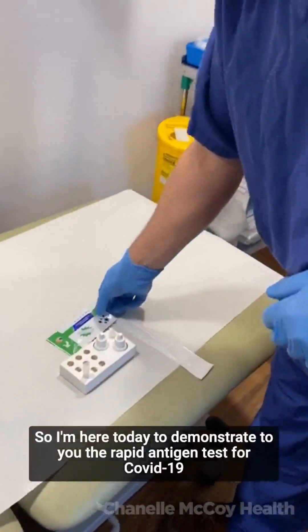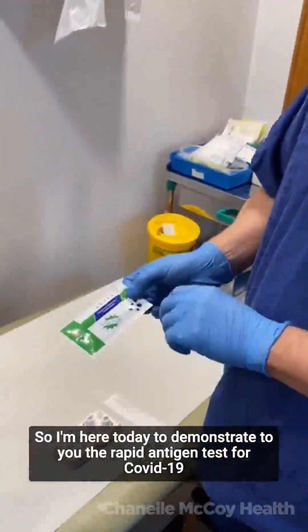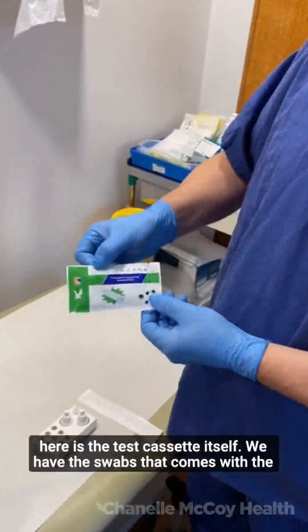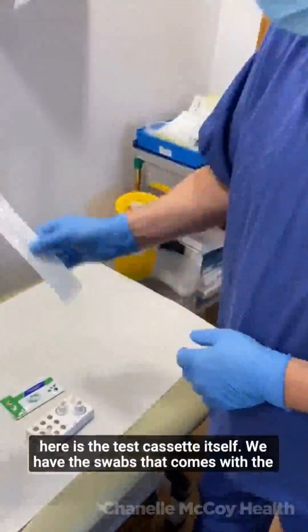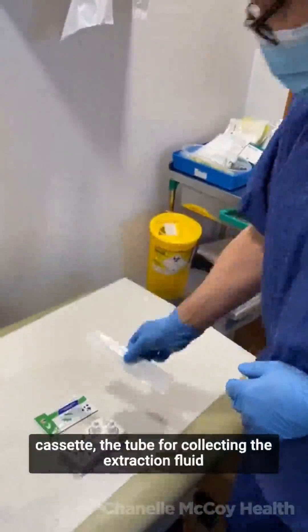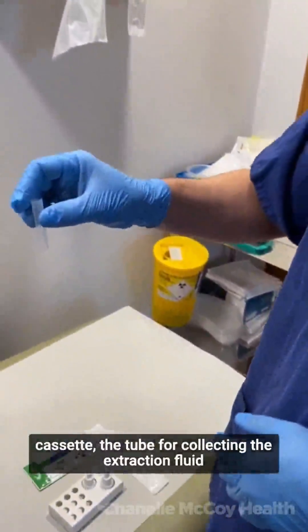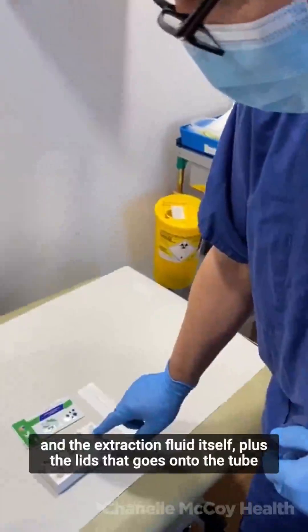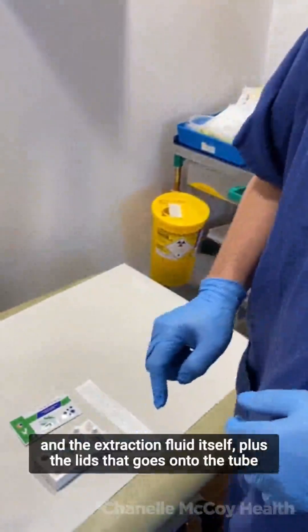I'm here today to demonstrate the OrientGene rapid antigen test for COVID-19. Here's the test cassette itself. We have the swab that comes with the cassette, the tube for collecting the extraction fluid, the extraction fluid itself, and the lid that goes onto the tube.